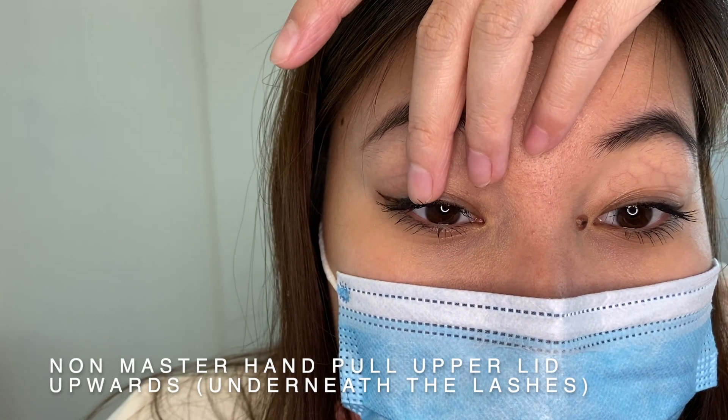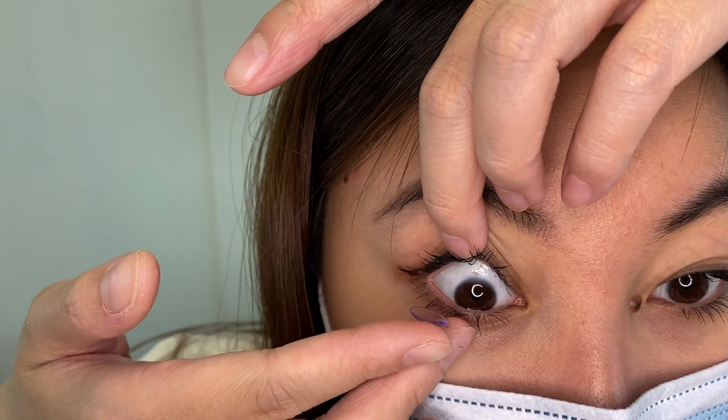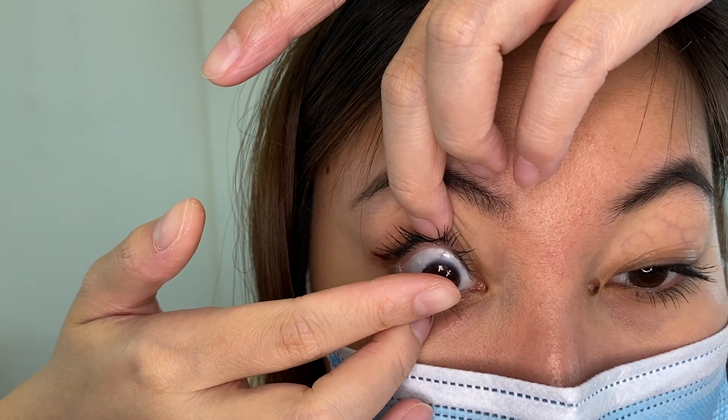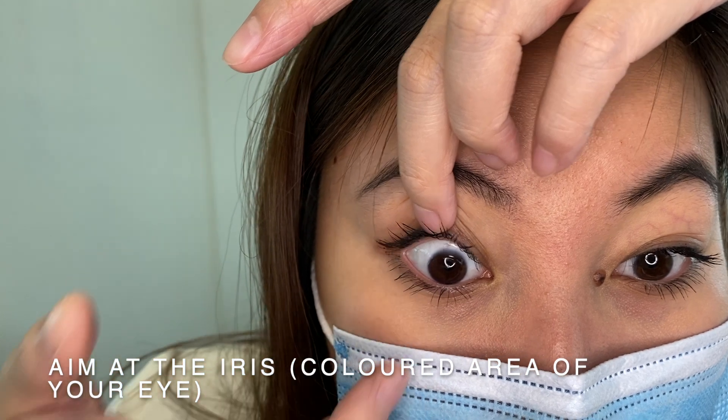Using your non-master hand, pull your upper lid upwards, exposing the white of the eye. Then use the middle finger from the master hand to pull down the lower lid, exposing the white of the eye. Then gently place the lens onto the iris.